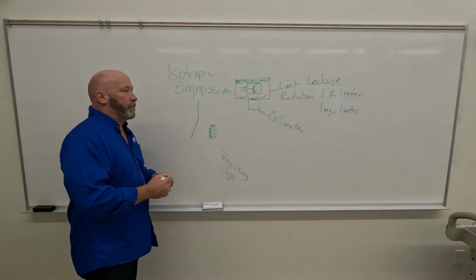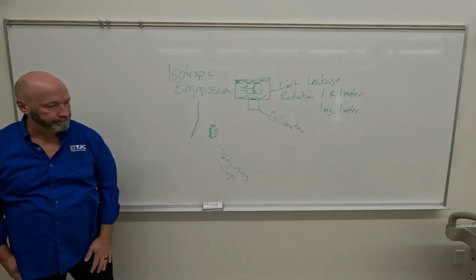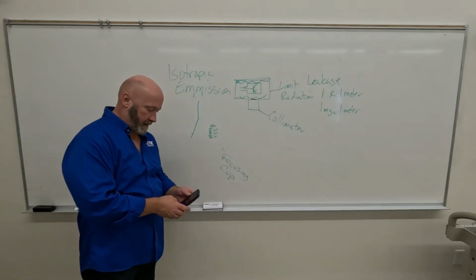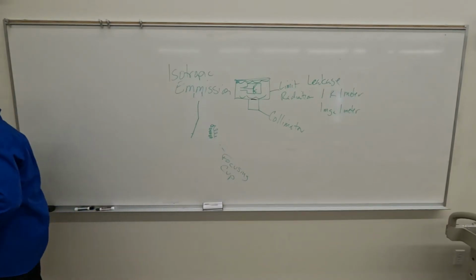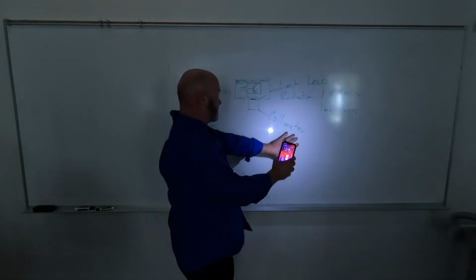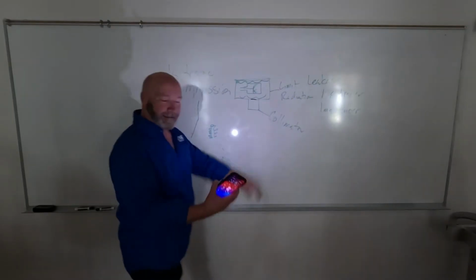So think about the difference between a regular light bulb and these light bulbs. Okay. So how's my shadow look? Small. Okay, it's small, but is it sharp? Yes. Okay. It's coming from just one little spot, right?